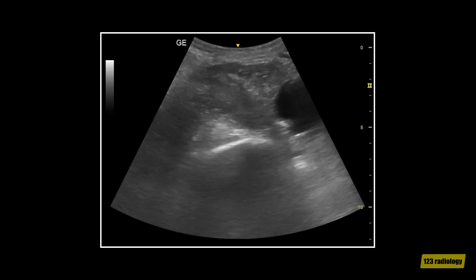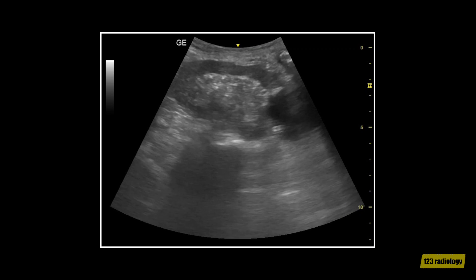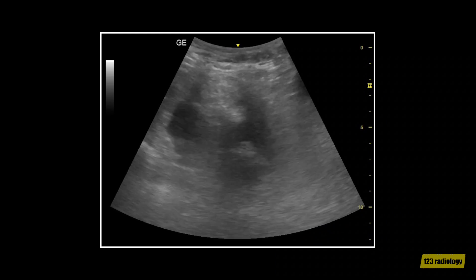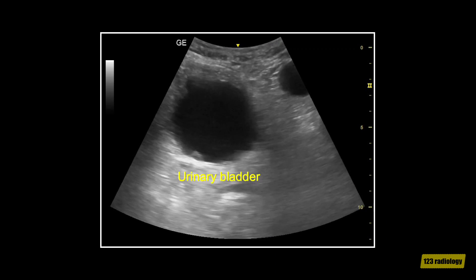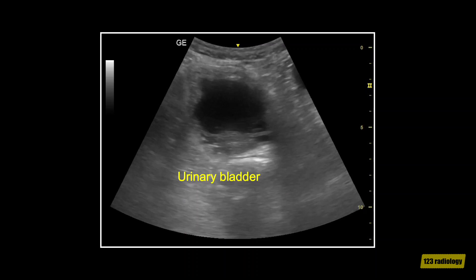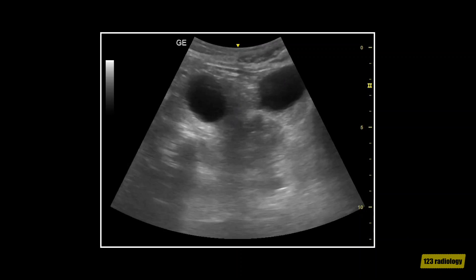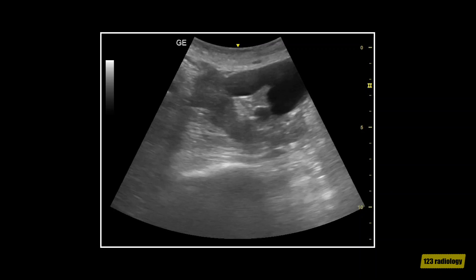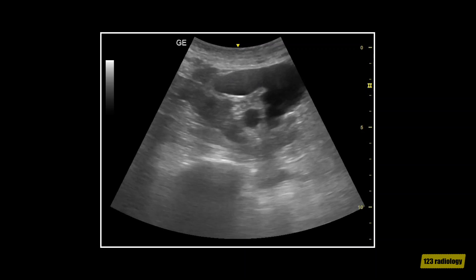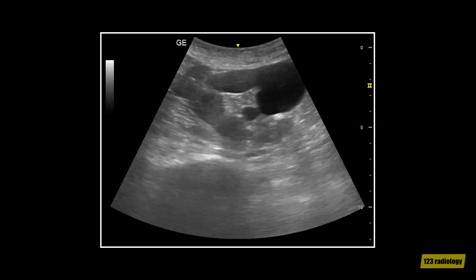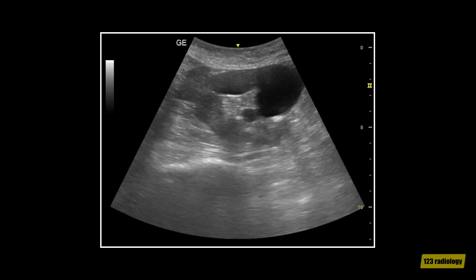This video clip shows a case of bilateral pelvic kidneys. As you can see, the right kidney is located on the right side of the pelvis in close relation to the urinary bladder. This is the left kidney. The left kidney is malrotated with its hilum facing anterior and the renal pelvis is dilated. Bilateral pelvic kidneys are rare but have been reported.